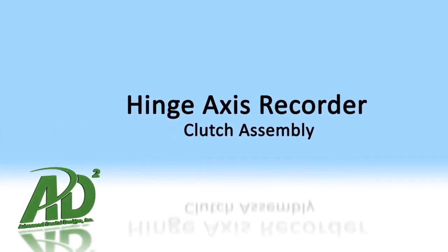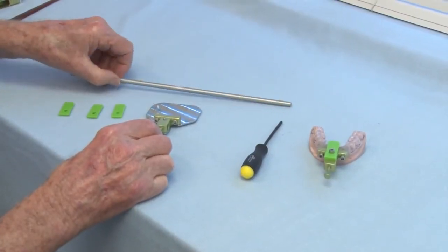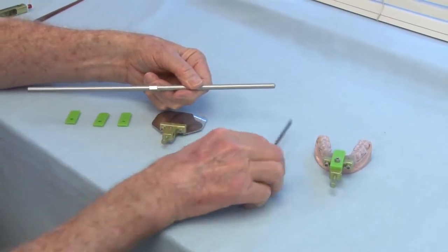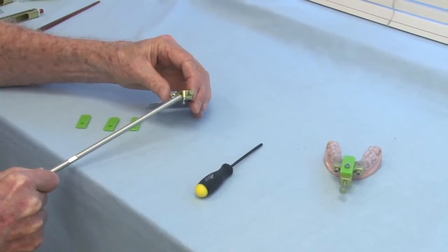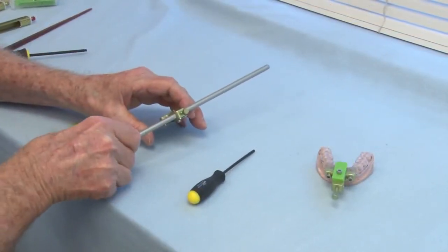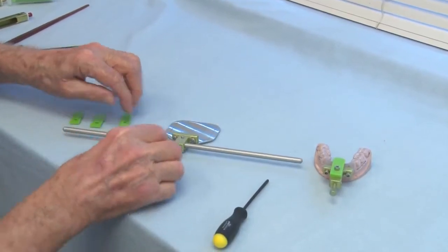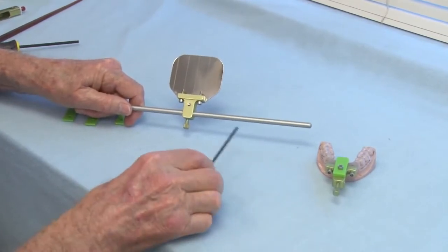I'm going to show you how the clutch assembly and holder is set in order to make the clutch that will fit on the patient's lower teeth. We use the side arm. You notice the side arm here has a cutout area here that fits. And so this would be how you would be set up to make your actual clutch.